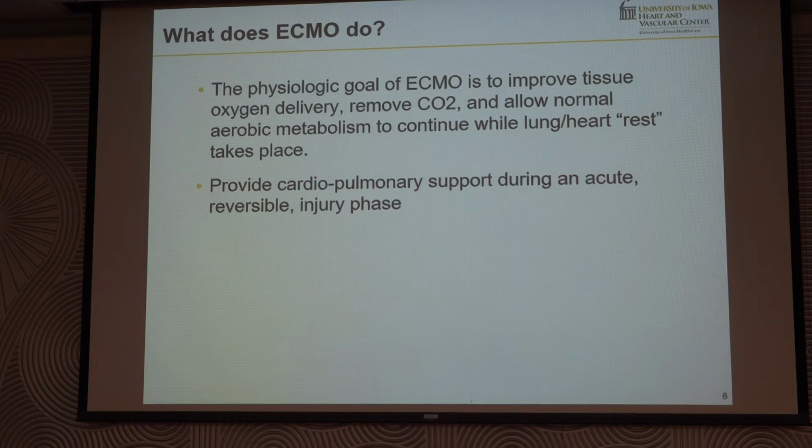And that's the key. This is not a therapy. It's not going to improve the organ at all. The organ has to heal on its own or be transferred to some other form of therapy. We're allowing the lungs and or the heart to rest so that they can possibly heal on their own.